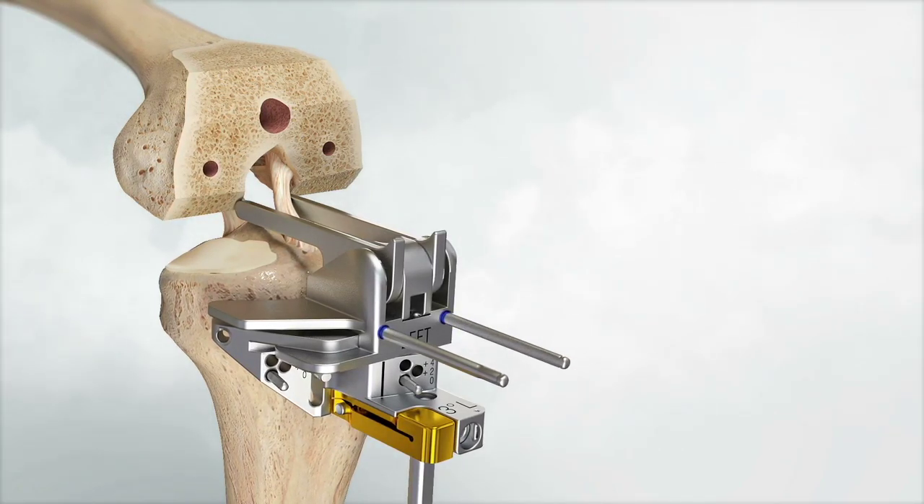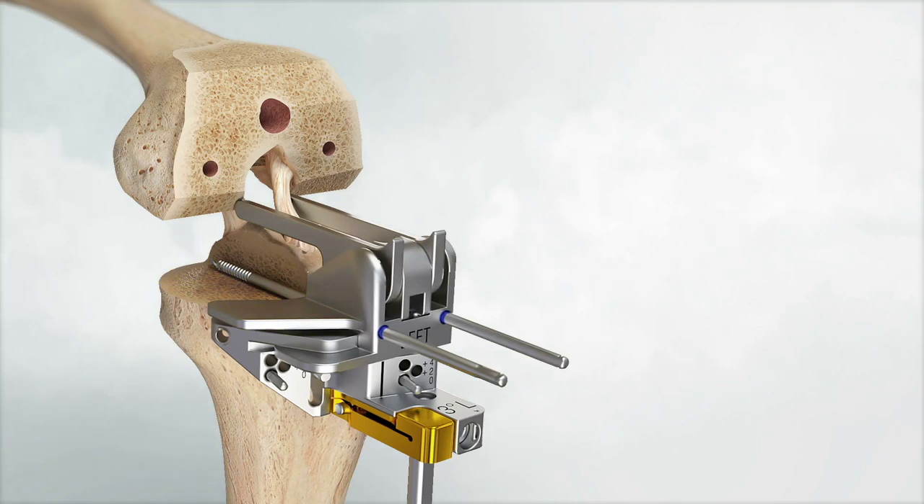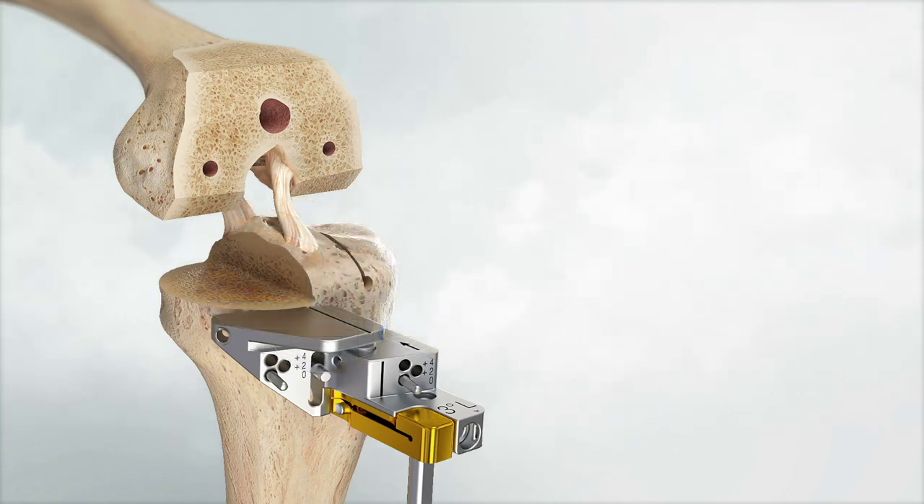Use a 1.5 mm thick reciprocating saw blade to make the medial and lateral sagittal resections first. Use a narrow oscillating saw blade to finish the medial resection. Remove the drills, pins, and orientation stylus. When removing the lateral drill pin, mark the hole as it will be needed during the lateral tibial cut step.